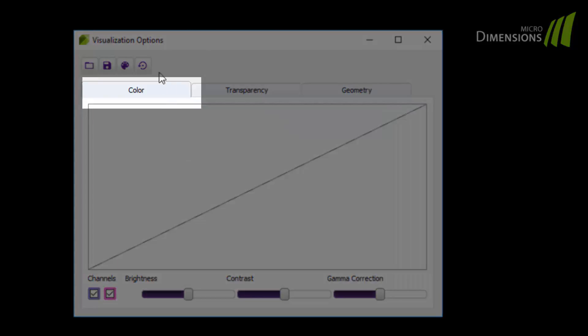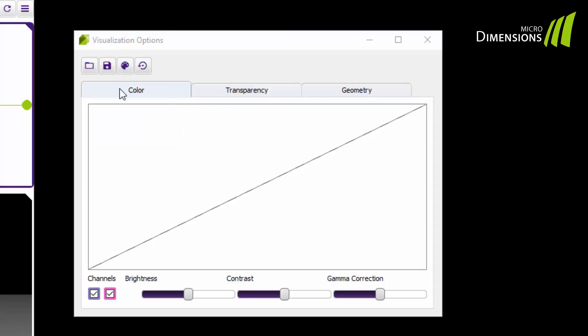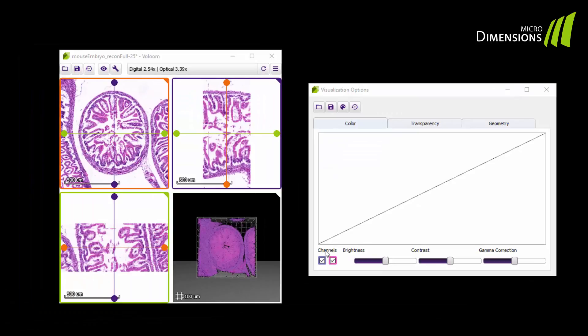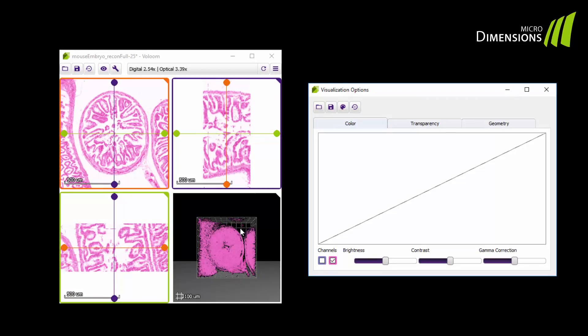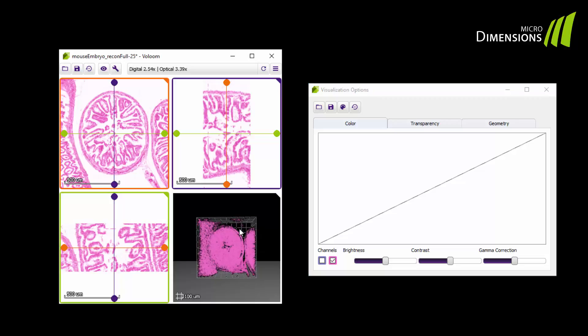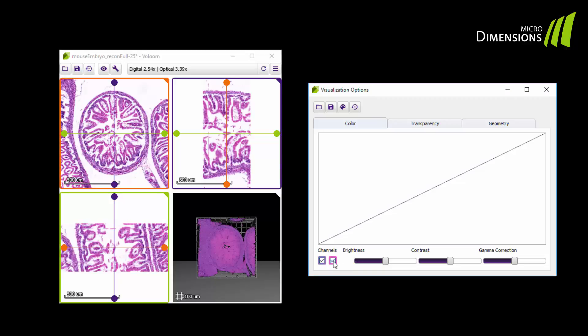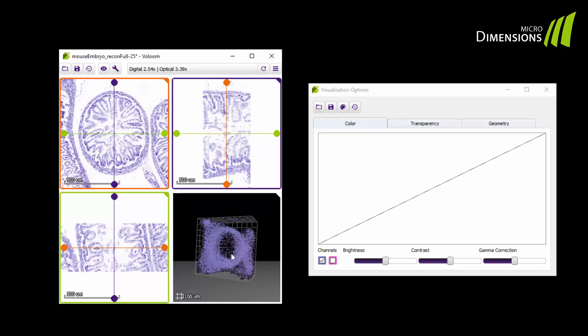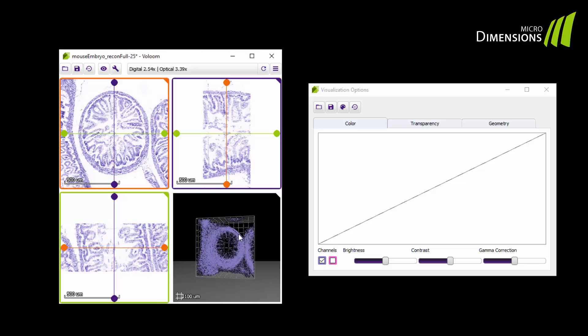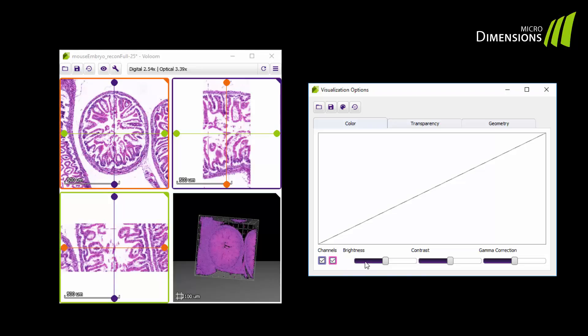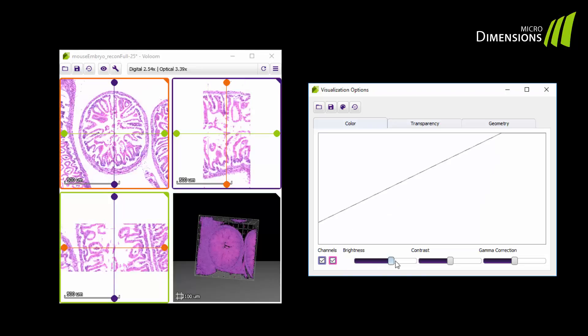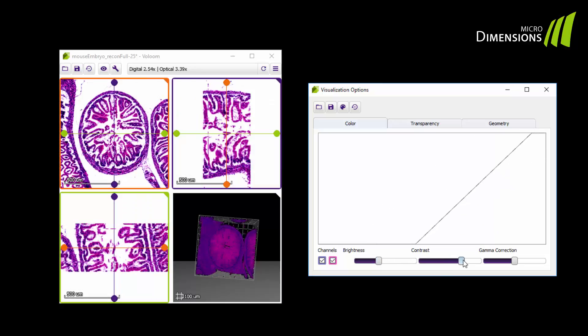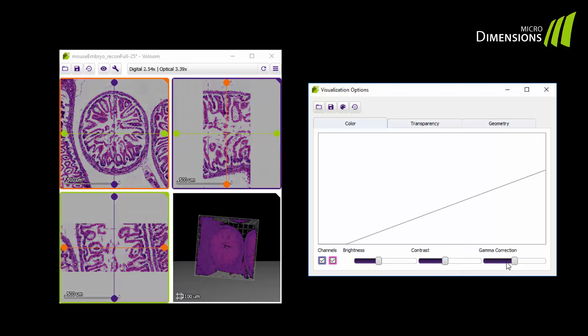In the color tab you can switch on and off channels like the hematoxylin and the eosin in this case. You can also change brightness, contrast and gamma of the volume rendering. You can see that the changes affect the volume as well as the 2D views.